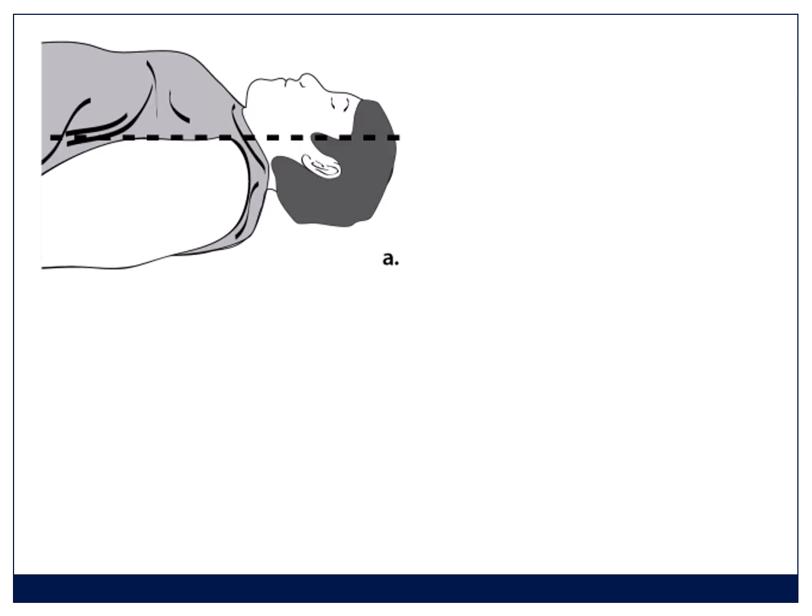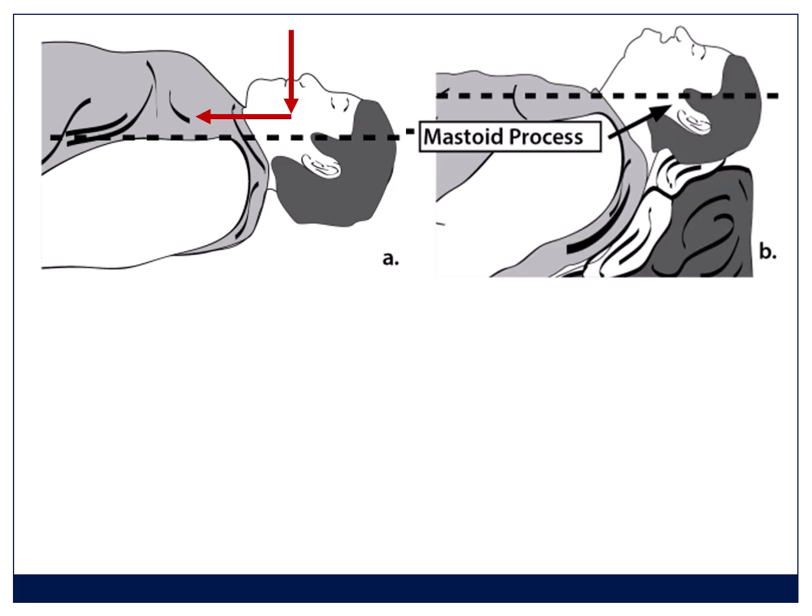The next thing is you want to position the patient correctly. And what you're trying to do is obtain a straight view to the larynx when you eventually intubate. And there's 3 axes in the airway. There's the oral, the pharyngeal, and the laryngeal axes. And as this illustration shows, when the patient opens the mouth wide and lifts the chin, you're not going to be able to see when you stick the laryngoscope in at that angle, because you're trying to see around the corner.